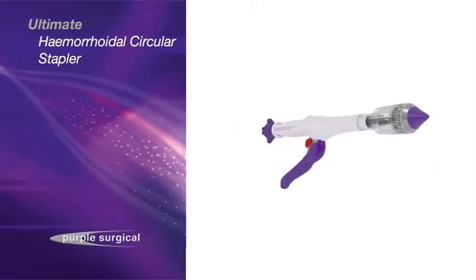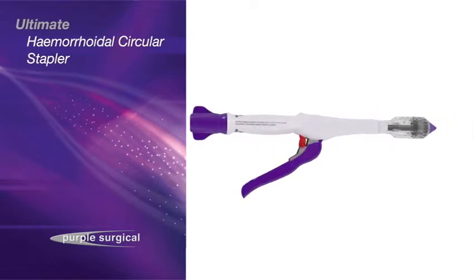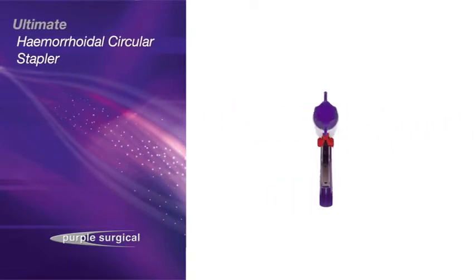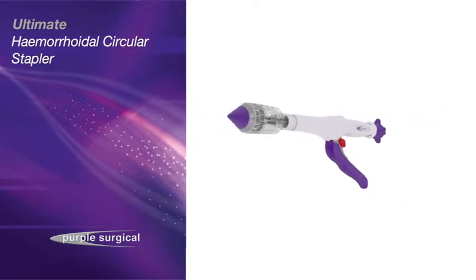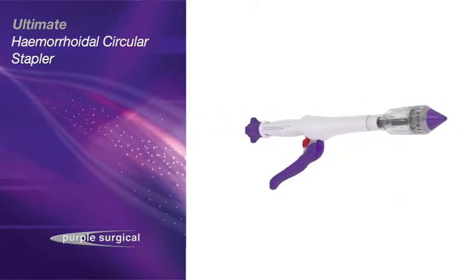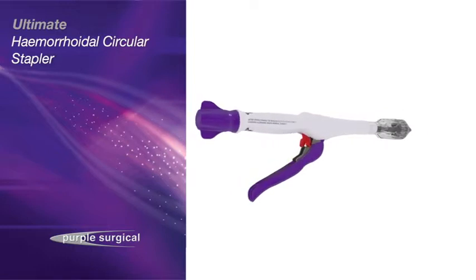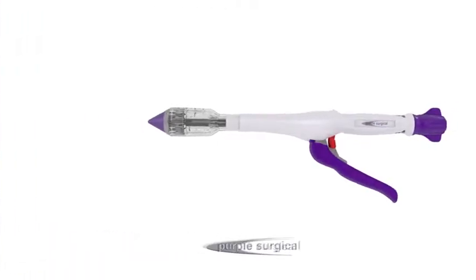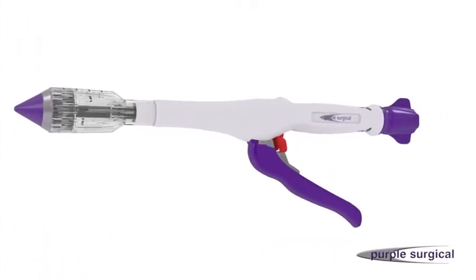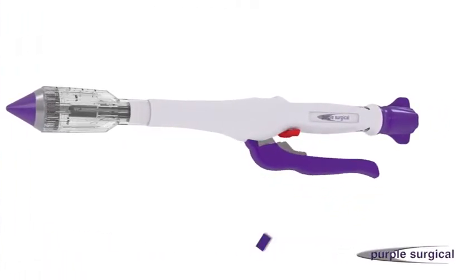The Purple Surgical Ultimate Hemorrhoidal Circular Stapler with Dual Safety and Transparent Cartridge is used in the surgical treatment of hemorrhoidal disease by placing a staggered circular double row of titanium staples in the tissue and resecting the excess tissue to create a circular anastomosis. The device can be activated when the handle is squeezed firmly to its limit.